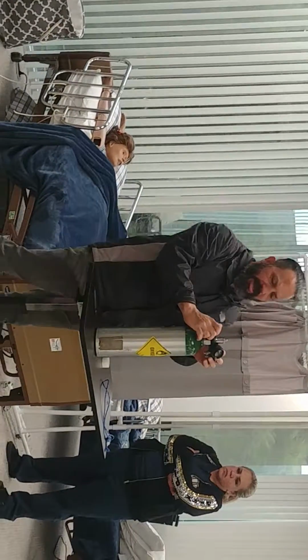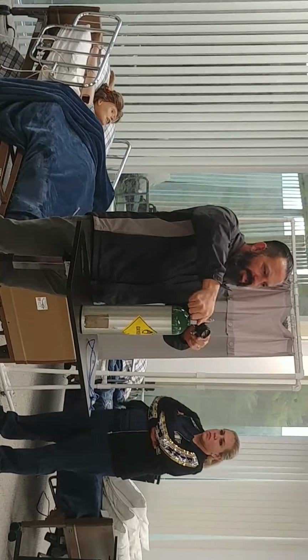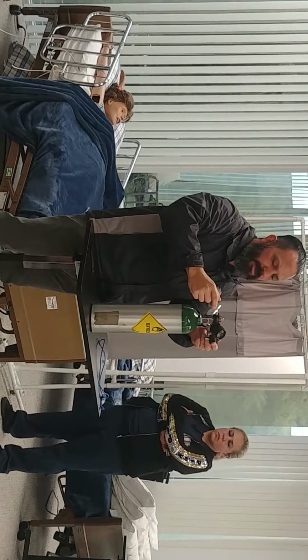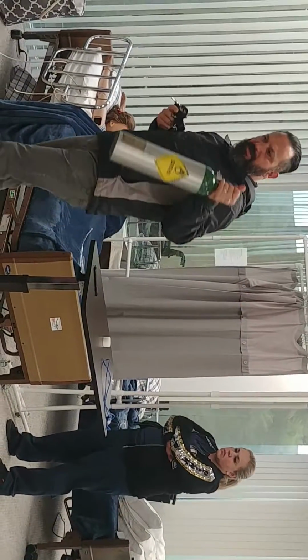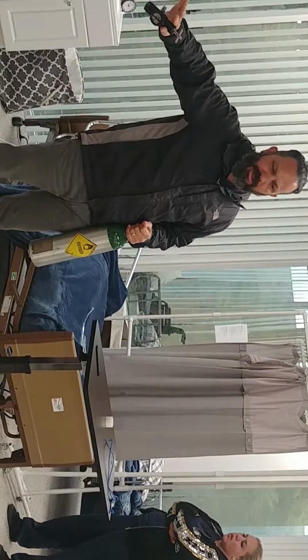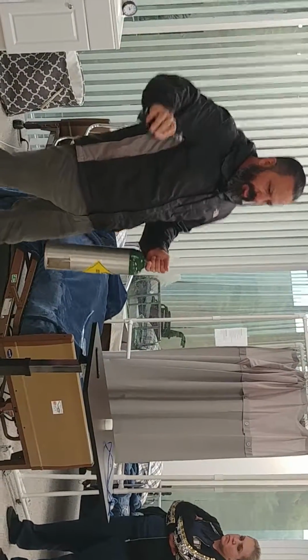The regulator, we have the yoke right here. The yoke is just what we use to tighten and close, open and close. So left to loose, right to tight again. So now we just lefty-loosey with the yoke, and we take the regulator off. So this bottle is done. We can go ahead and take this bottle and secure it. Normally when you swap out oxygen cylinders, you hand them to somebody, depending on how your company does it, and they store it securely, and then they'll give you a new bottle.